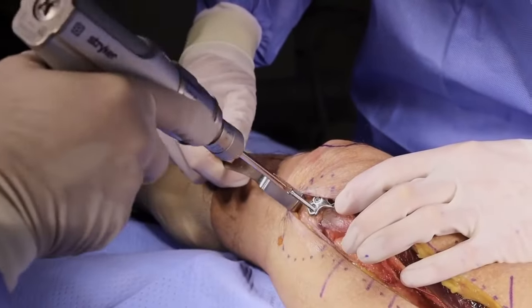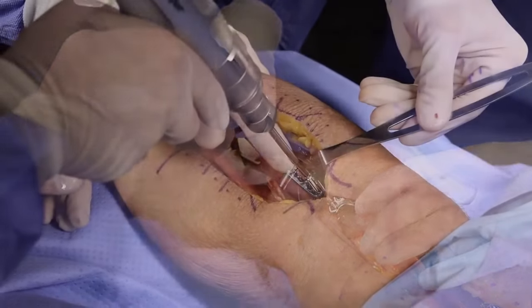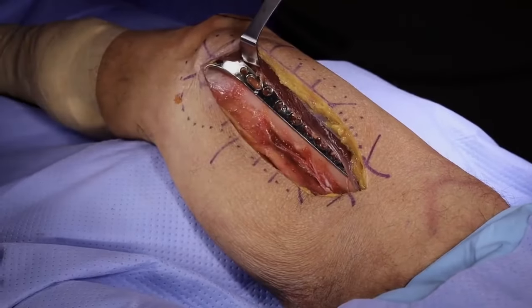Primarily, the medial plate is utilized to add stability to the construct, particularly in patients with poor bone quality. However, in some cases with a high degree of medial comminution, the medial plate may also be used as a reduction aid.